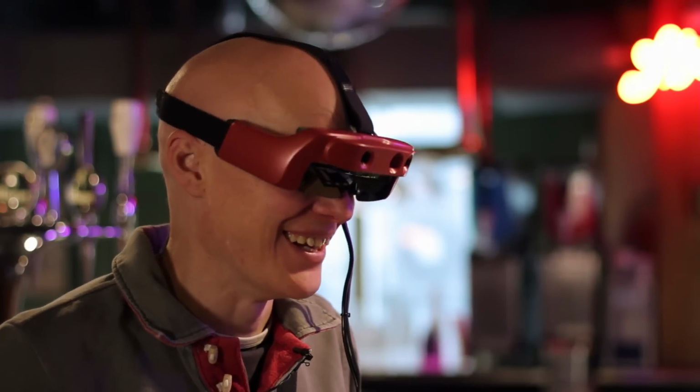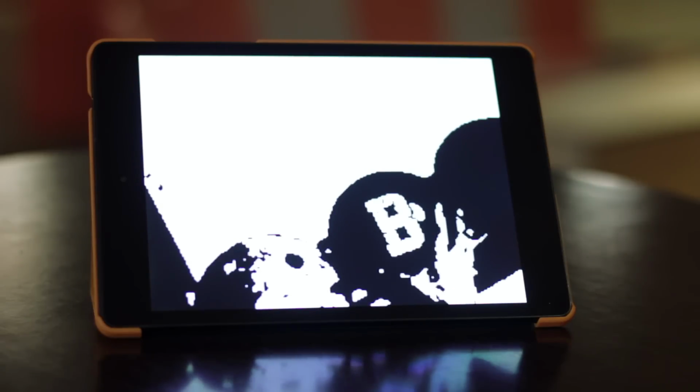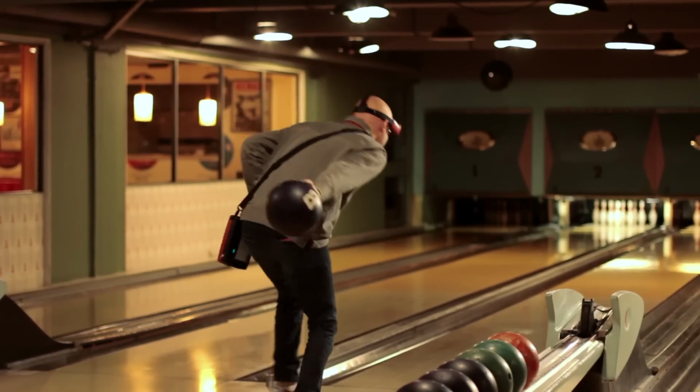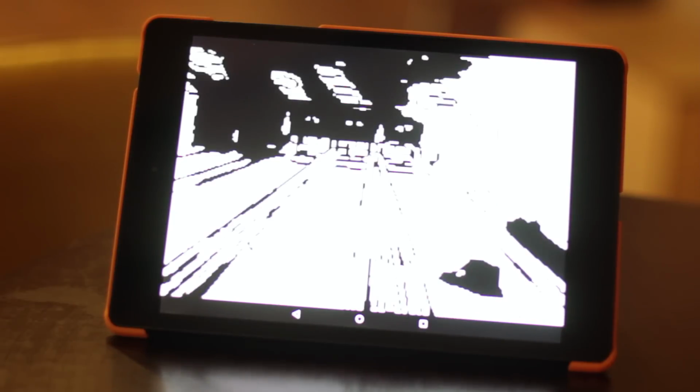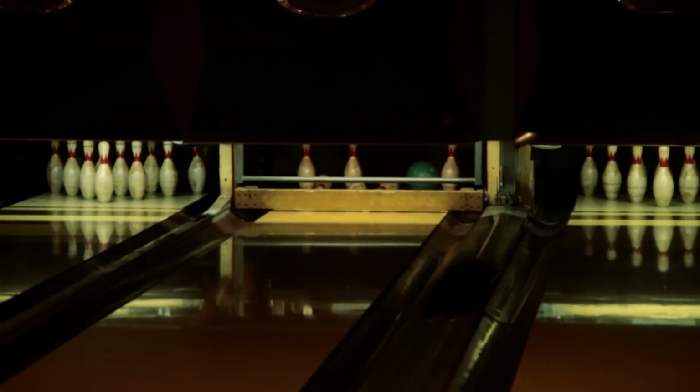So the glasses have a number of different settings. First of all, we have a low light setting which just looks at the distance to objects, and it sort of shows them like a 3D image. But then they have richer settings, like a high contrast one which turns everything into a cartoon, and then just a straightforward color mode which allows someone to zoom in and pause images just like a normal camera would.